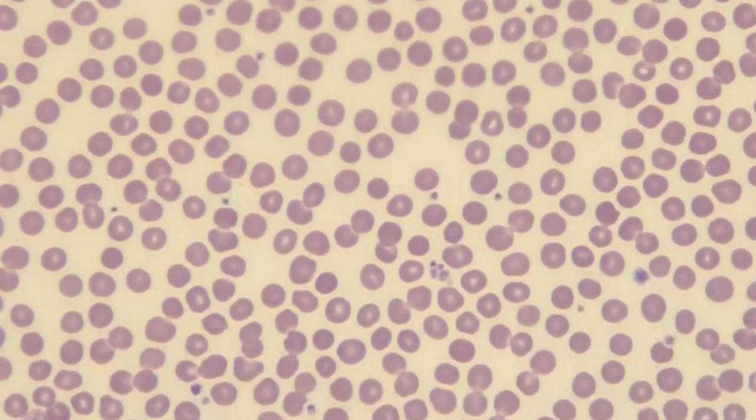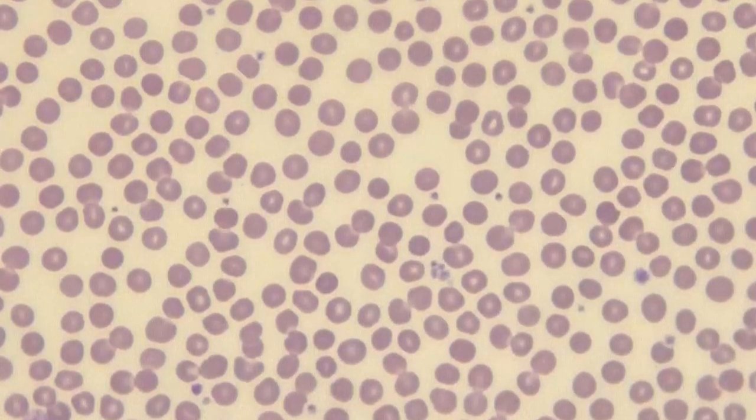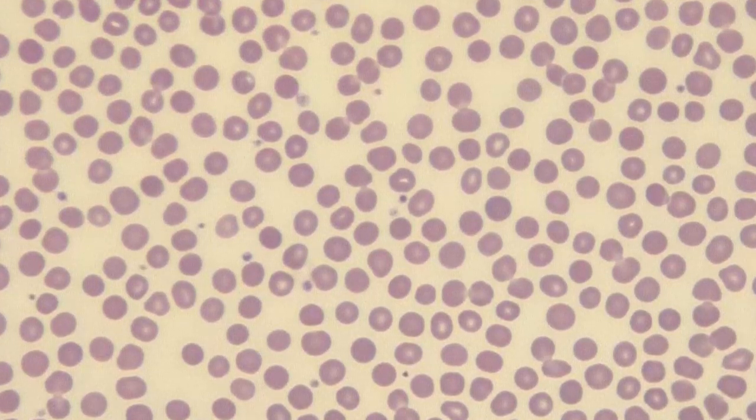And platelet clumps are something that you could think you would see if you look at the analyzer printout and see that the patient has an abnormally low platelet count. But like I said, on this particular patient, the platelet count was normal, or everything was normal. Therefore, I feel pretty confident about the distribution of the red cells, the white cells, and the platelets. I also feel good about the staining of this particular slide, and I think this is a very good slide that you could use to do a differential on.